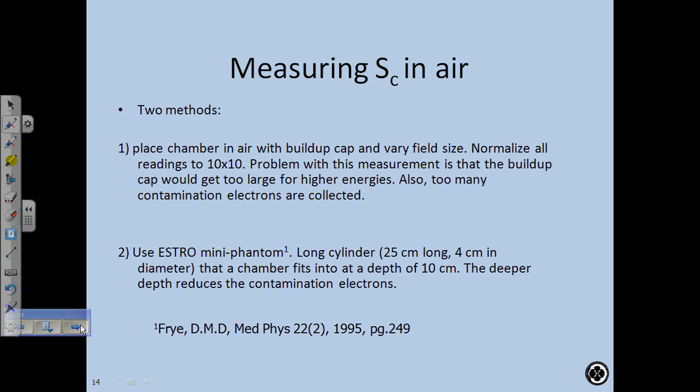Okay. But then we run into this problem again with the chamber and the buildup cap, and we can't get down to a small enough field size. So what people have been doing for several years now is using this thing called an ESTRO mini phantom. ESTRO just stands for European Society of Therapeutic Radiation Oncology. ESTRO mini phantom, there's the reference.